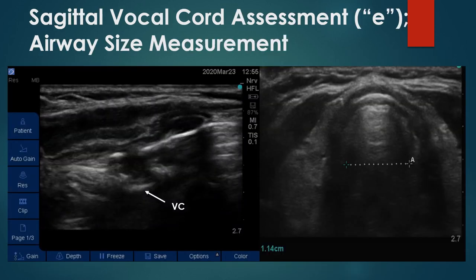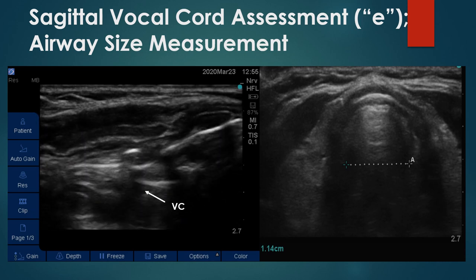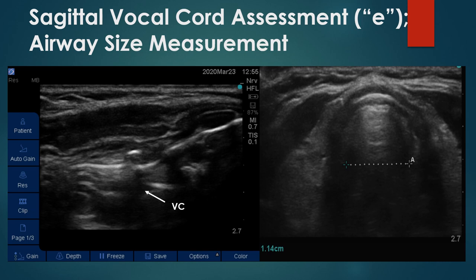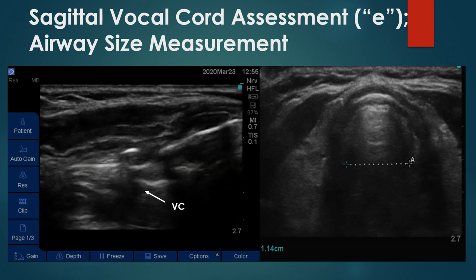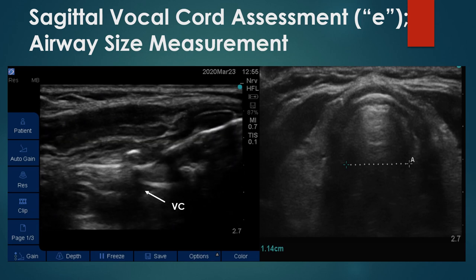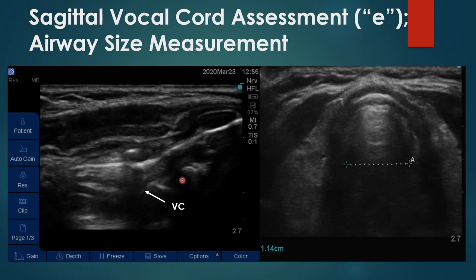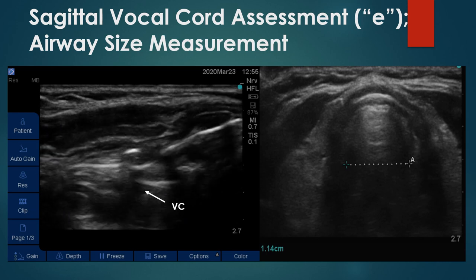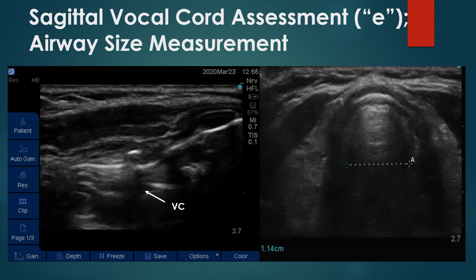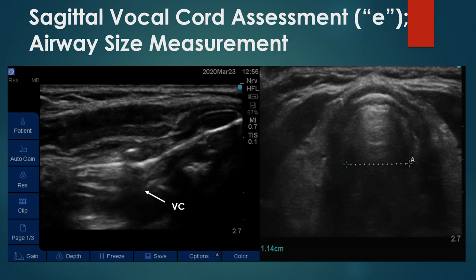An interesting use for airway ultrasound comes when you're trying to evaluate recurrent laryngeal nerve damage, of course. One of these uses is I typically go in a sagittal plane or longitudinal plane just to the left or right of the vocal cords. And you can see here I did a little check on my wife, and you see the letter E being said with her vocal cords. So obviously she's doing well with that. I'm not sure if you can't get the same degree of utility out of just saying the letter E, but I think that you can actually discriminate between left or right recurrent laryngeal nerve damage with this technique.